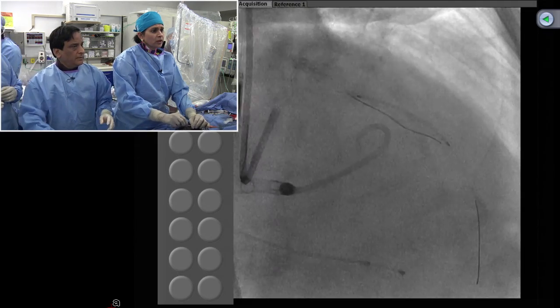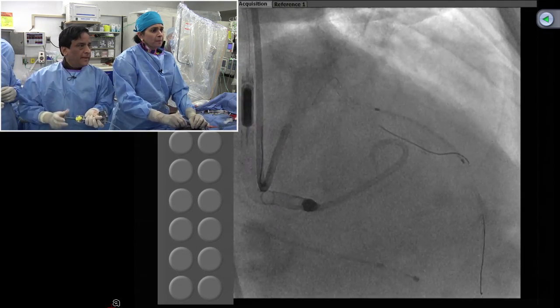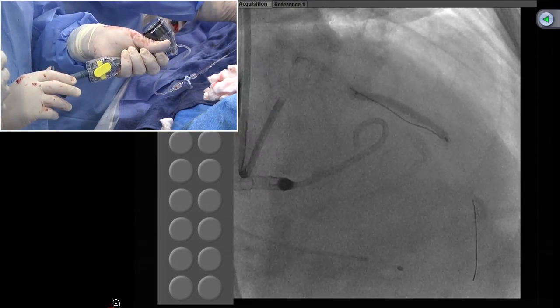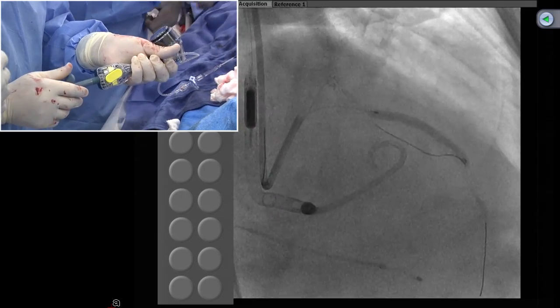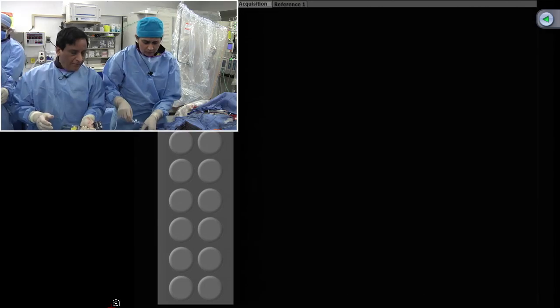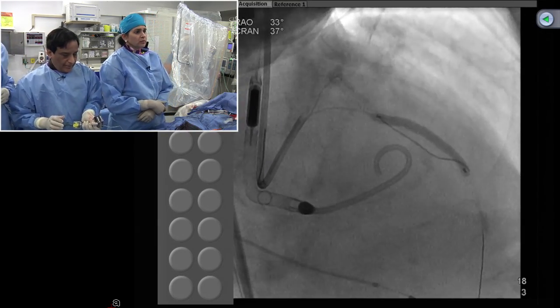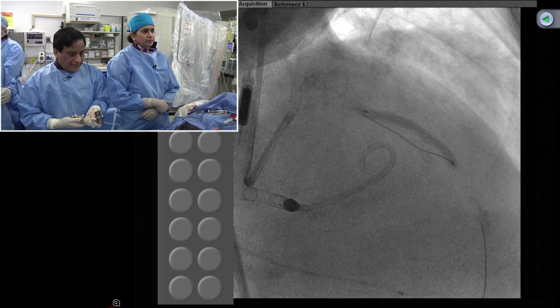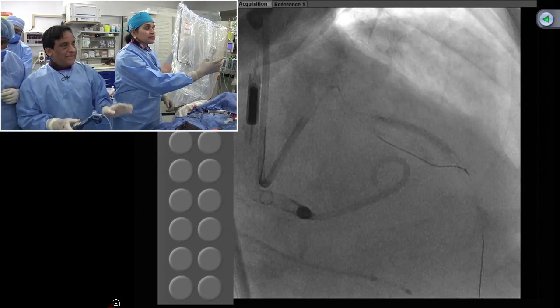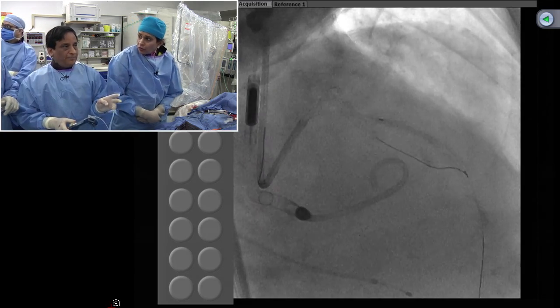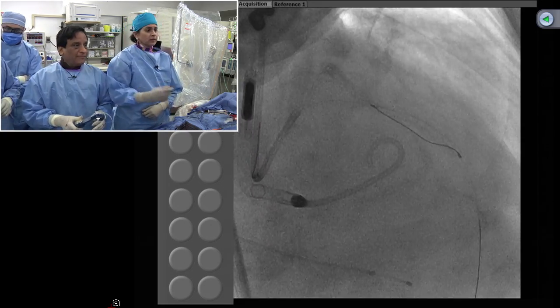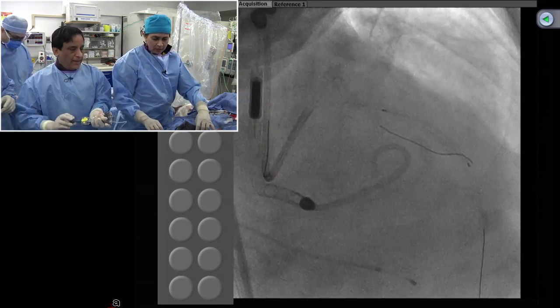Even if you're not all the way there, sometimes all these little edges — I'm going up to cover it — it's easier after you post-dilate. I really, while we are still finishing, want to mention: I forgot to thank Dr. Waxman and the CRT team for giving us the chance year after year to show the cases of Impella with atherectomy. We have done two times orbital and three times rotational atherectomy, and all cases in the last five years have been with Impella assist.